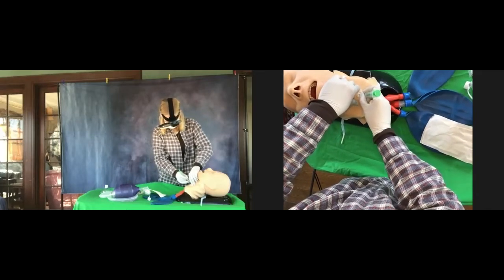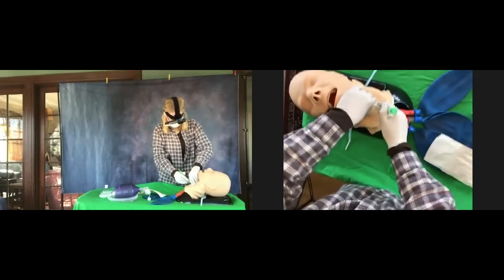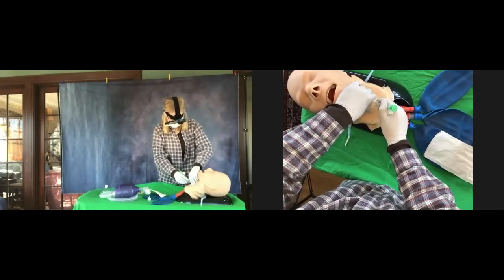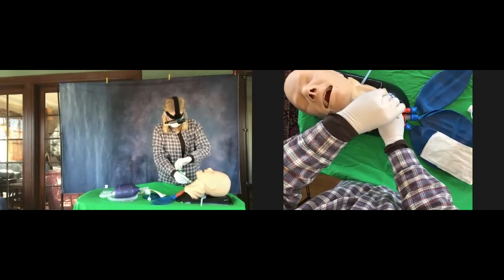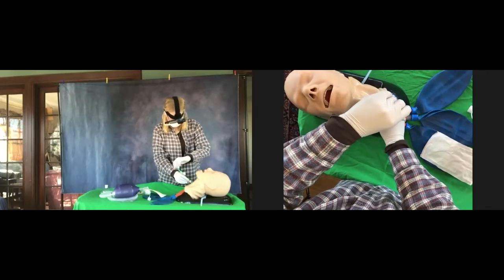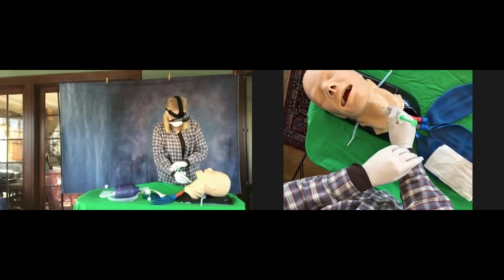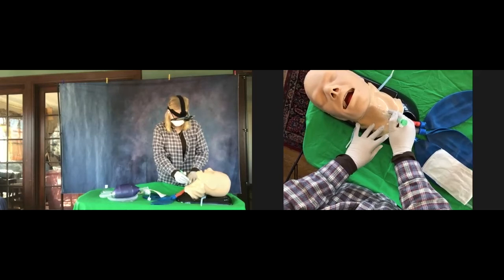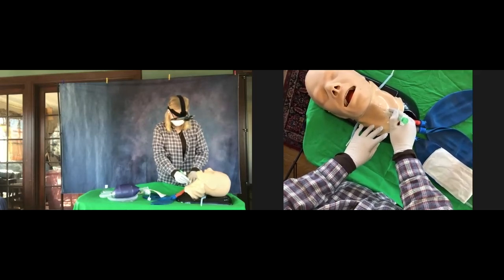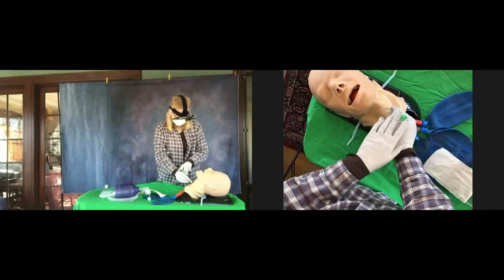Feel it pop through. Good. Now with your left hand, you're going to take the syringe and slowly aspirate. With your right hand you're going to tilt the whole thing. Don't aspirate too much yet — you're going to aspirate as you advance. Go ahead and push that syringe plunger back down. You're going to tilt the whole thing 45 degrees up towards the patient's head. Tilt it towards the patient's head.